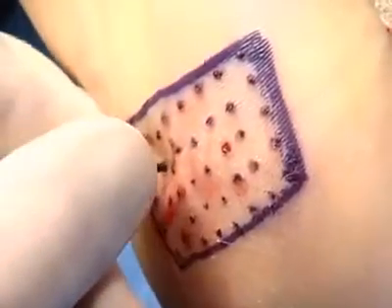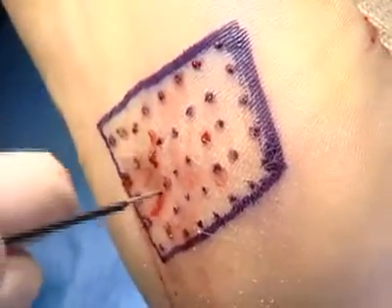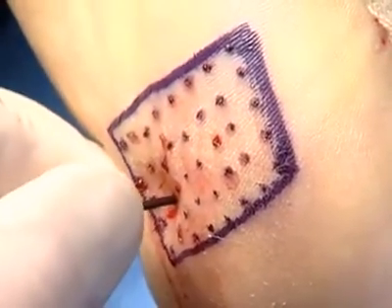For demonstration purposes, we are utilizing intraoperative X-ray to show you the level that is utilized to penetrate both the skin and the plantar fascia. This shows, first, the K-wire penetrating the skin and getting to the resistance of the plantar fascia, and then this is showing the Topaz wand getting the resistance of the plantar fascia and then penetrating the plantar fascia both through the plantar fascia and deeply, while stepping on the pedal to release the Topaz energy to stimulate the healing of the plantar fascia. This procedure is then performed through every hole that has been created by the K-wire.